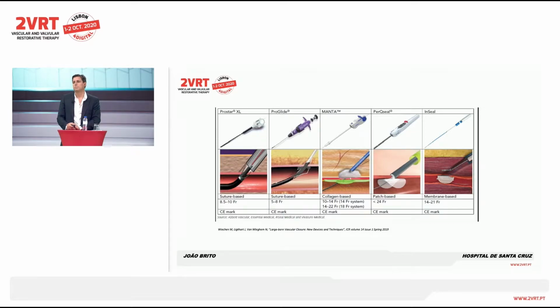This technique evolved regarding the implantation of TAVI, evolved to the use of the 2 ProGlide, which I know is still the most common closure technique and the most common device used in cath labs worldwide.